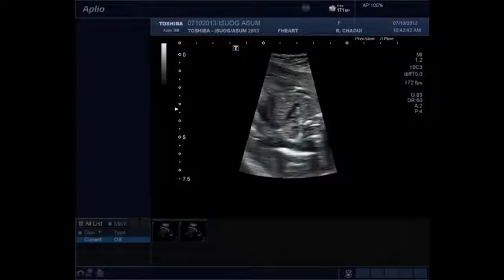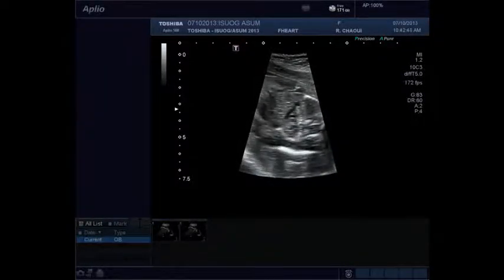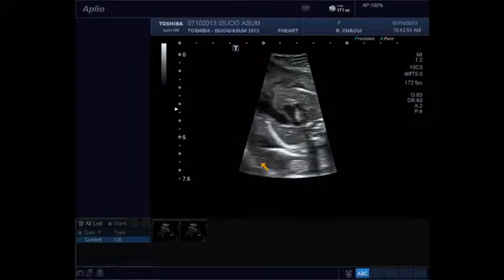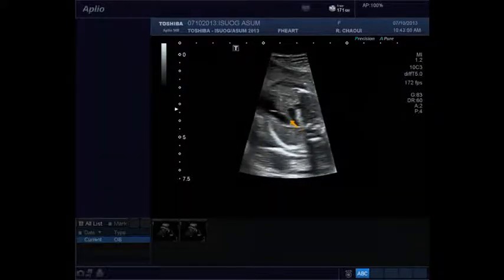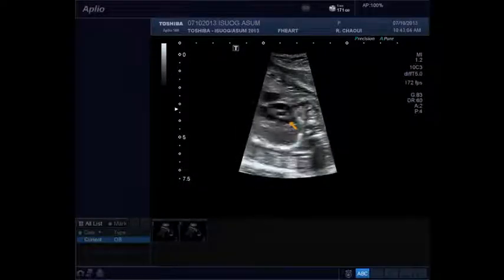Could you go into the aortic arch and the sagittal, parasagittal? Okay. The sagittal view of the aortic arch. Yeah. Now, this is a tricky question, because I need a plane exactly here along. I will try to rotate along the arc and then demonstrate.